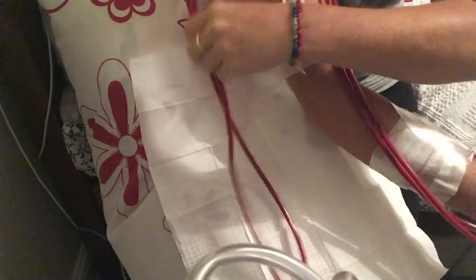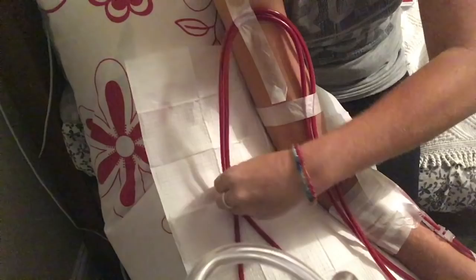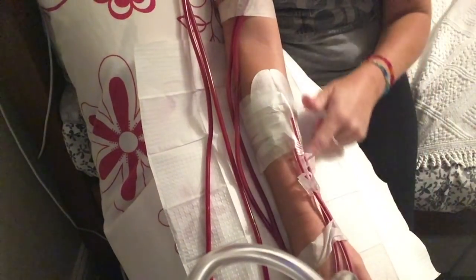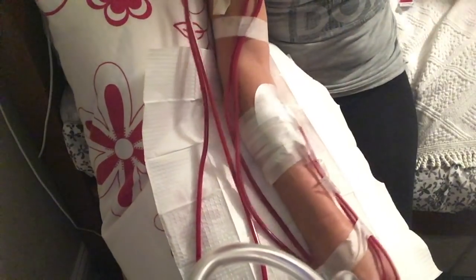I know that if I were to pull on the lines in the night at all, all it would do is pull on this piece of tape here. It doesn't do anything to where my actual needles are.